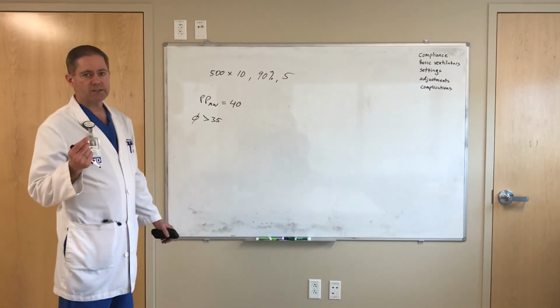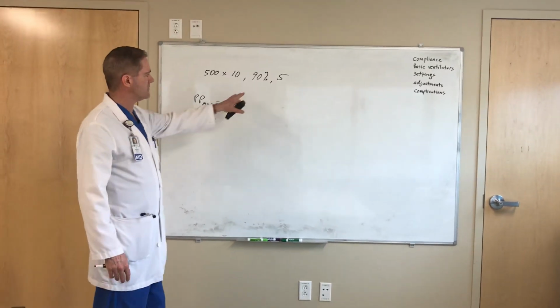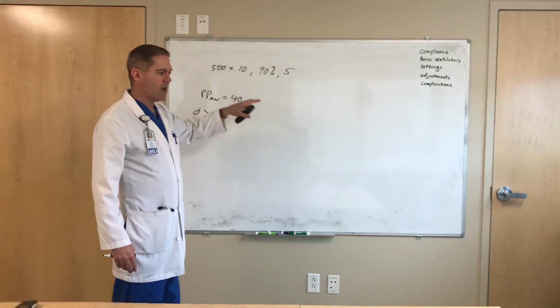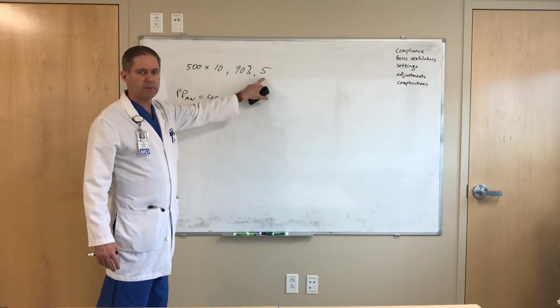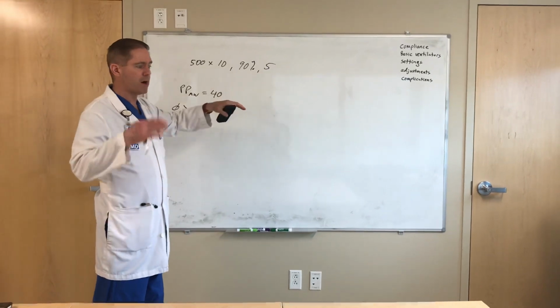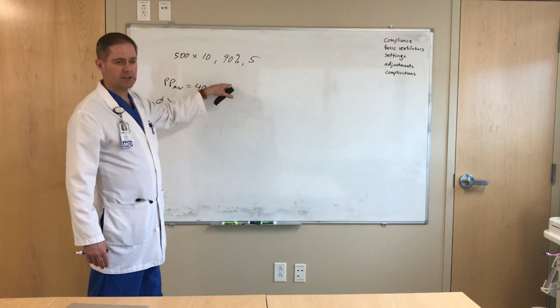Look at your pulse oximetry. Make sure you have a good pleth. If my pleth is 99%, you can start to come down on this. If your pleth is telling you you're in the 80s, then you might have to start creeping up on the PEEP. Don't be afraid to go up to PEEPs of 16 or 18, and then gradually come down on the FiO2.